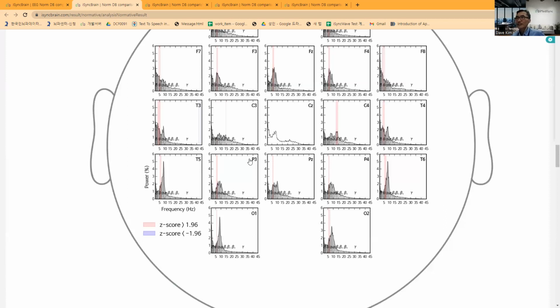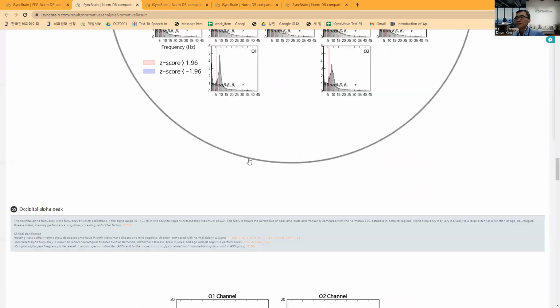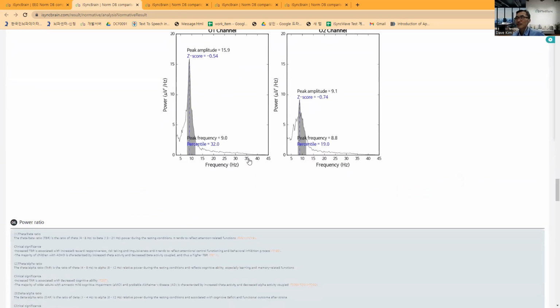We can estimate, combining this kind of activity, especially the central SMR excessive pattern in her case, is the counterbalancing activity for delaying the memory decline.